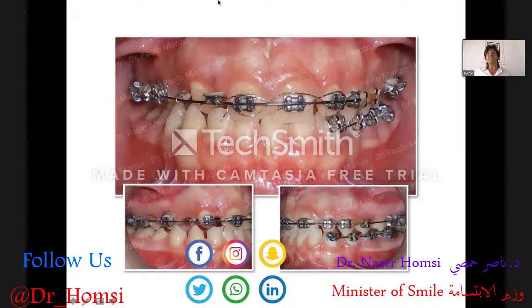And when I asked her, please bring me your daughter, finally, after 1 month, she came with the daughter, and this was the situation of the treatment at that time. So you can see some broken ligatures, some broken lace backs, a piece of wire going gingivally, pushing the canine in pre-contact with the upper lateral incisor, some debonded brackets, a very bad situation.